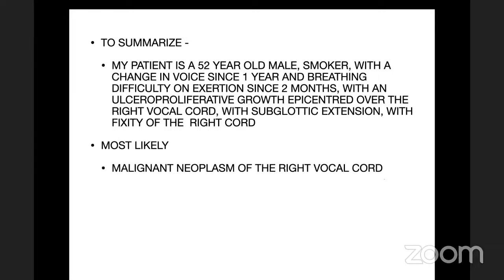And I think again I stand corrected, Ratan and all. You divide supraglottis, glottis, and subglottis by this line, 1 centimeter, 5 millimeters. The glottic region starts in the middle of the ventricle. If you draw an imaginary line across the ventricle, everything below that is the glottis.